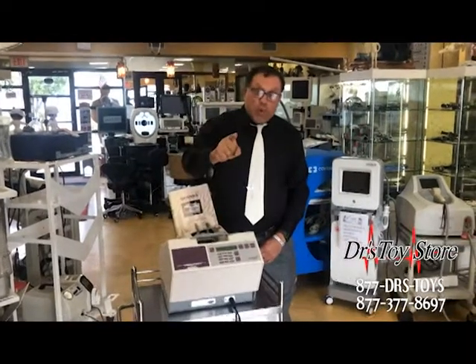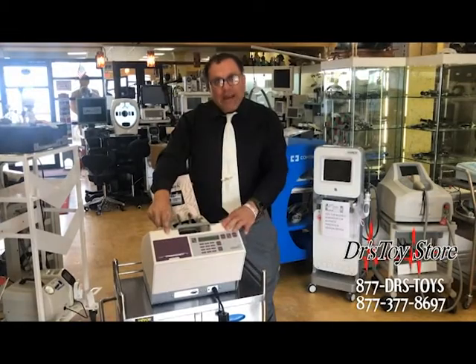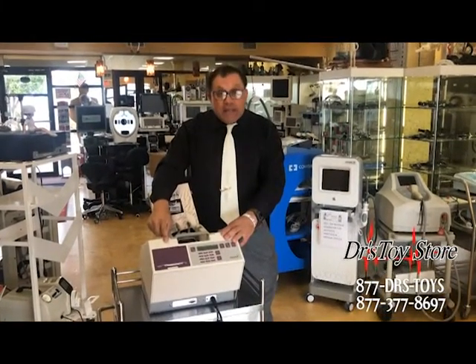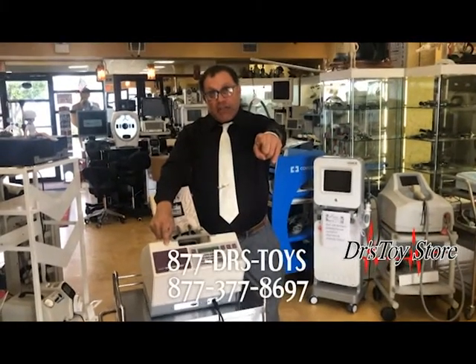We have deals at the Doctor's Toy Store — this happened to be one of them. Call today and get your Sahara Elogic foot bone densitometer scanner. It'll save lives. 877-DRS-TOYS.